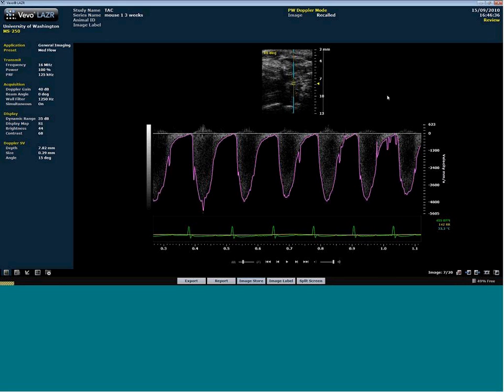And speaking of chart, if anybody is interested, either contact Andrew or myself. We have a Doppler frequency chart that we made up that shows all of the probes for the 2100 and the maximum Doppler speeds that they're able to get up to.